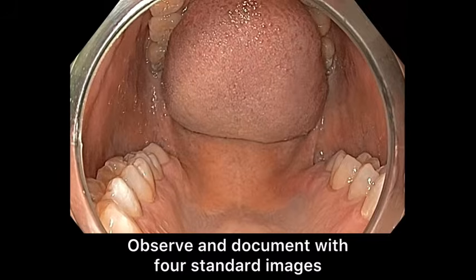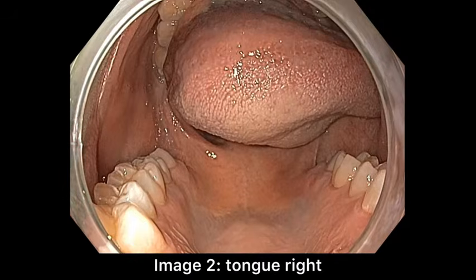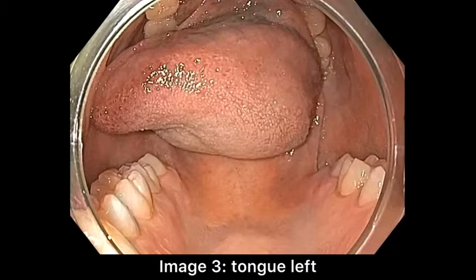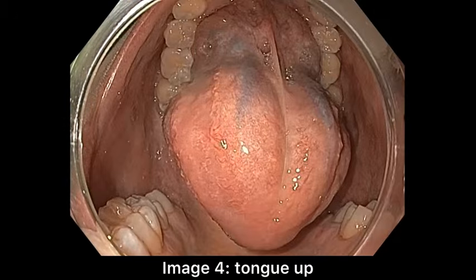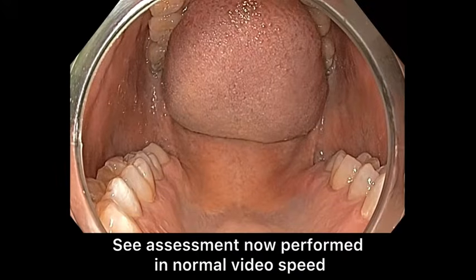Observe and document with 4 standard images. Image 1, tongue down. Image 2, tongue right. Image 3, tongue left. Image 4, tongue up. This completes the oral cavity assessment pre-endoscopy. Please see the assessment now performed in normal video speed.